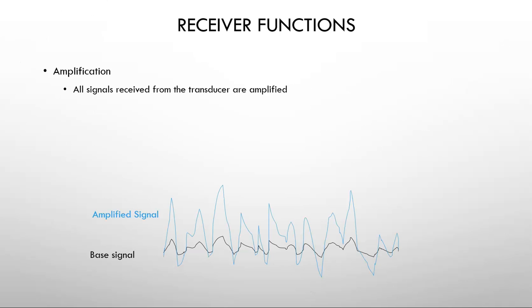So amplification, all signals received from the transducer are amplified. And so here's a small diagram that tries to show that. You get a base signal back from the transducer, and then the entire thing gets amplified, just simply making the entire signal bigger.